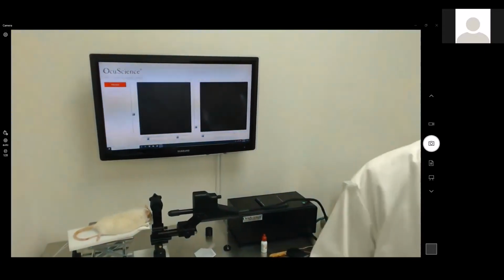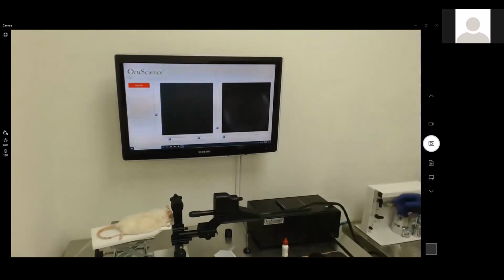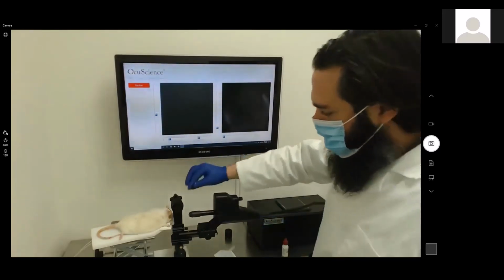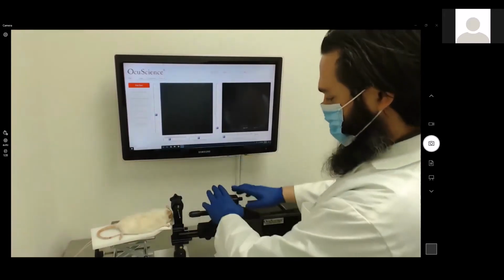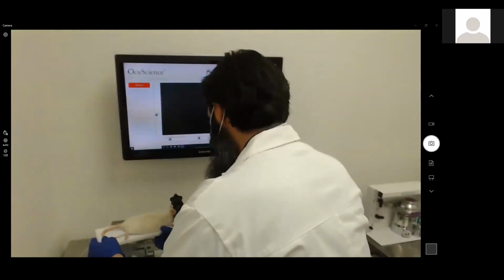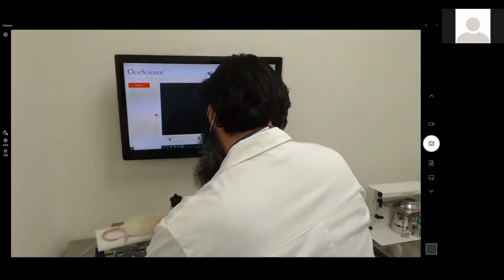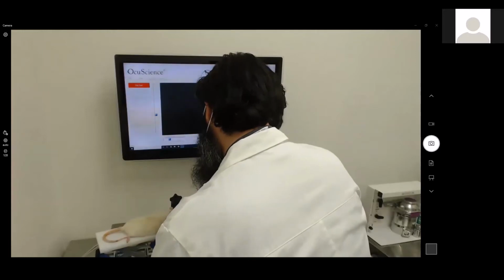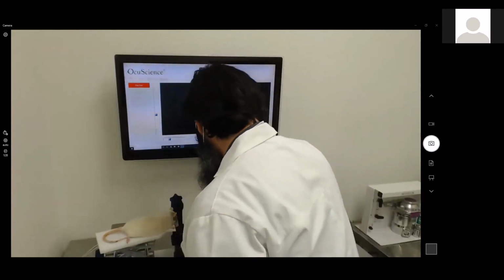Okay, so Sean, you want to take this over? I guess the first thing to do is we're going to look at the cornea. Yeah. The same thing as with the fundoscope earlier. As we mentioned, we have our pointer that will help alignment. The pointer works the same for the fundoscope and our OCT. We can align the eye up to the pointer here. Now, the rat, of course, is a little bit heavier, so it might take a little more adjusting to get him just right. But I've got him where I want him, and I will take this pointer off.